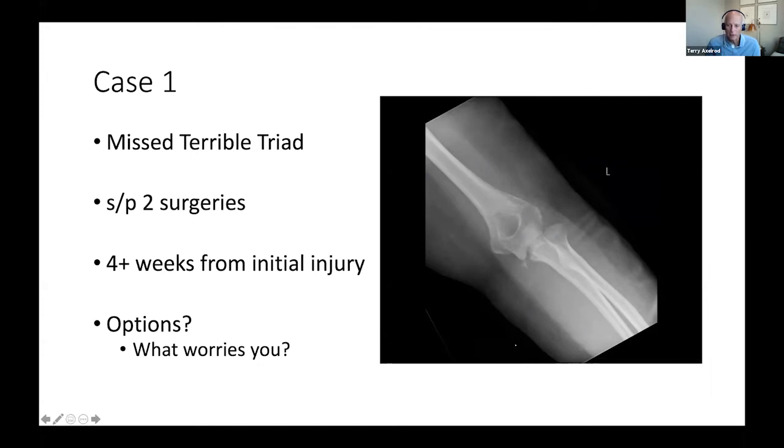That tells you that everything is just massively swollen inside and there's this new bone being deposited. Some of it is going to really make the reduction almost impossible. The other thing that's worrisome is that if you look at this PA x-ray, the capitellum looks pretty absent to me. I don't see a nice outline for it. I see 3/4 of the trochlea, or most of the trochlea, but then the radial head's not really up against anything. So has there been some erosion of the capitellum with that radial head being out for so many weeks?